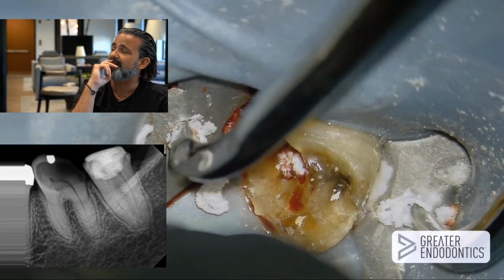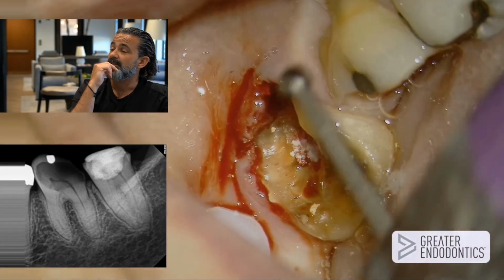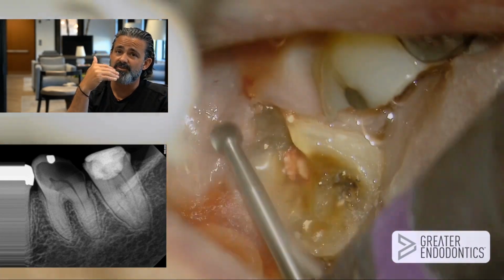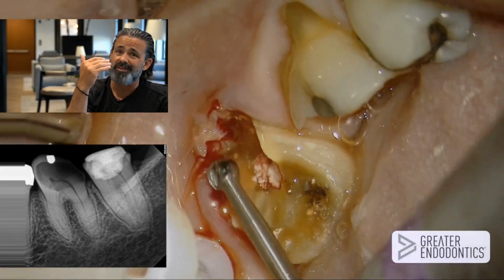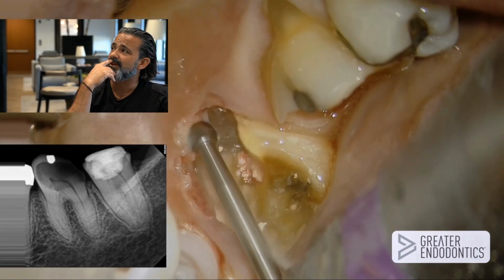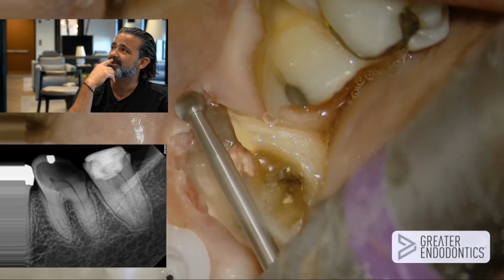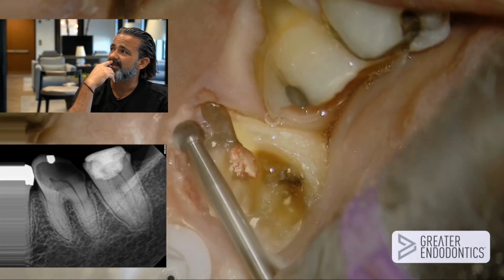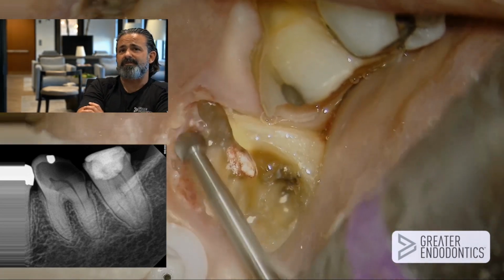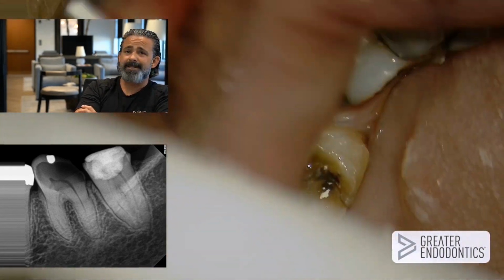You'll see that technique. But I got to stop. I don't like where it's headed. So I'm going to just take a round burr and just do a sort of modified, not really crown lengthening. It is on the buccal, but I'm going to remove some of the gum tissue, some of the tissue tags that were already there from the previous doctor's work, and just some of that ischemic tissue I'm just going to remove off and just try to better refine where the margins really are of this tooth. It's compromised at this point.